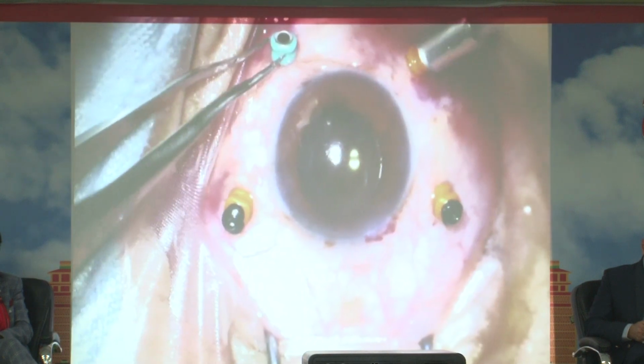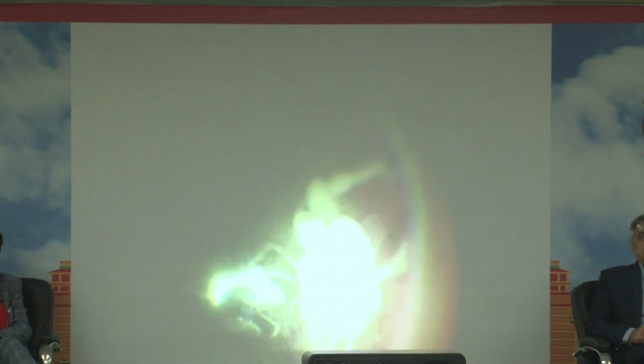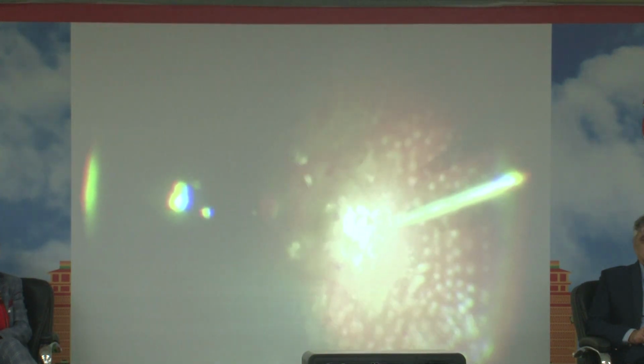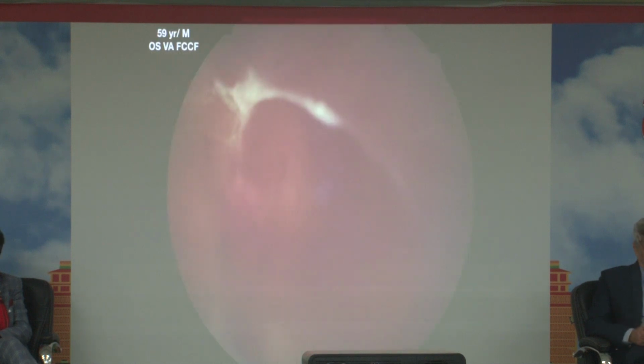So we always use a chandelier illumination because it helps to do a self-indentation. Most important is the posterior hyaloid in patients with PDR. So we have to make sure that we remove the entirety of the posterior hyaloid. Then we check the periphery and do a vitreous base shaving. And finally, a pan-retinal photocoagulation. And depending on whether there's a break or not, we decide to go for an oil or a gas injection. So the patient did fairly well, a one-eyed patient.